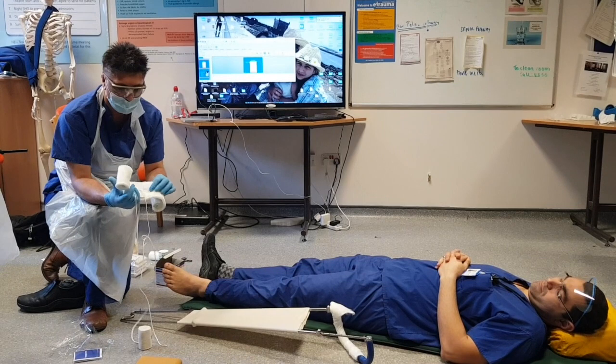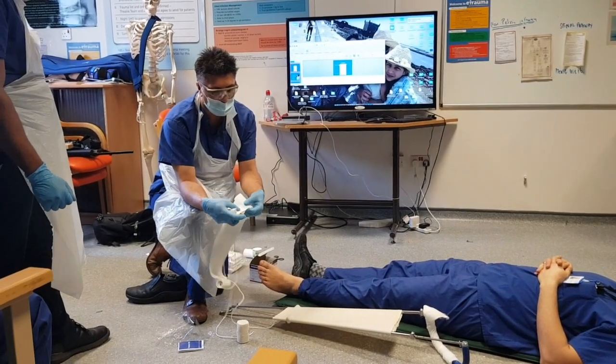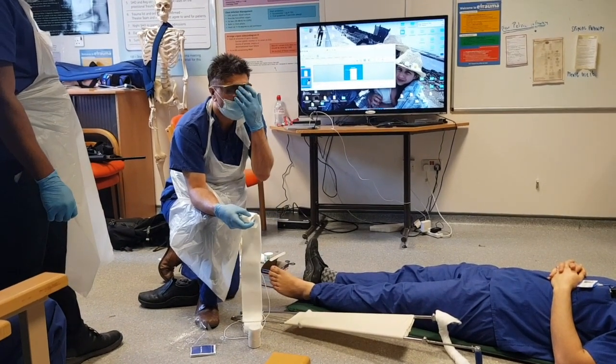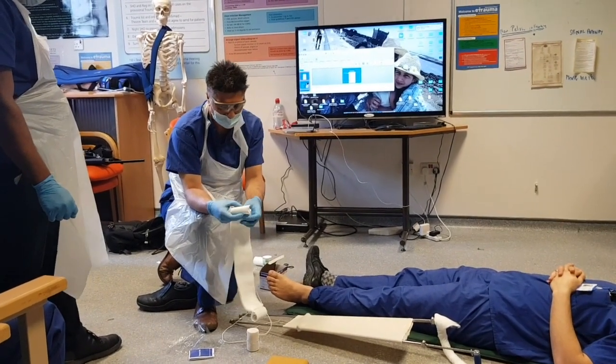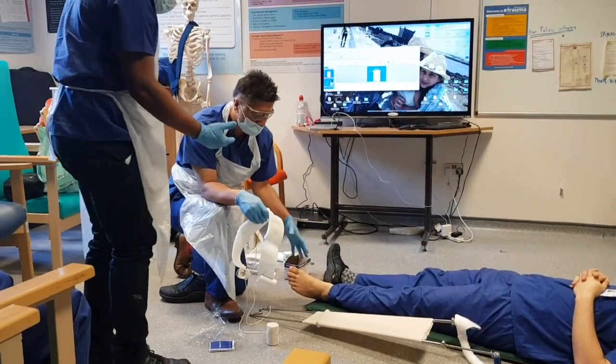This is essentially some reinforced foam, and it's got some sticky material on the side that is going to adhere to the patient's skin, and that's going to allow us to get the traction. What I'd like you to do, in order to help me, is just apply traction to the leg.